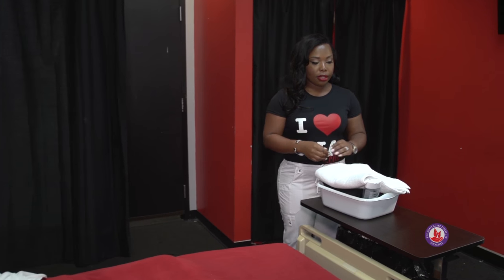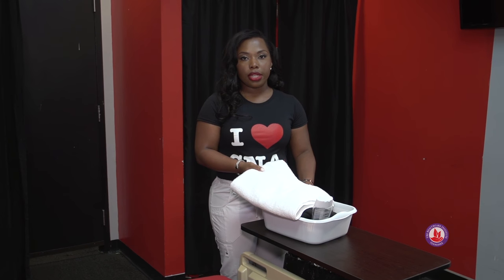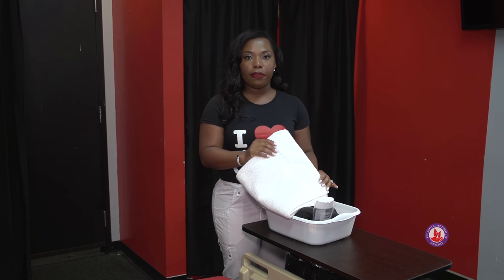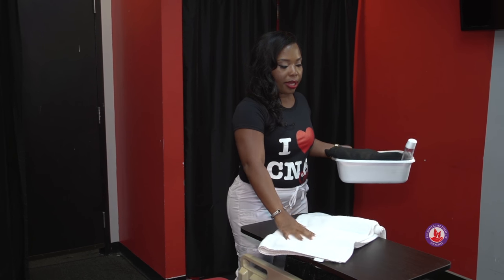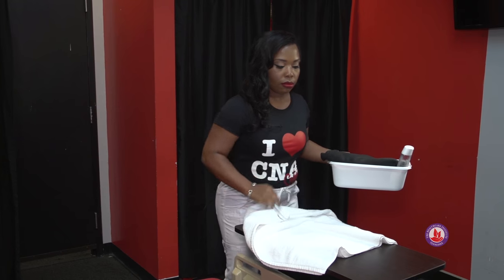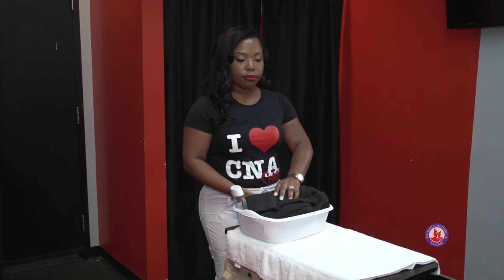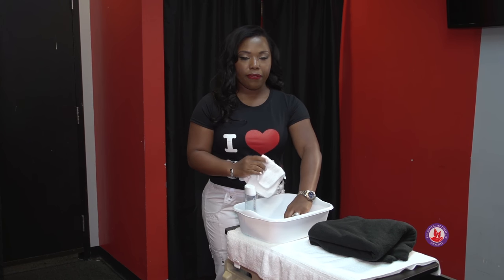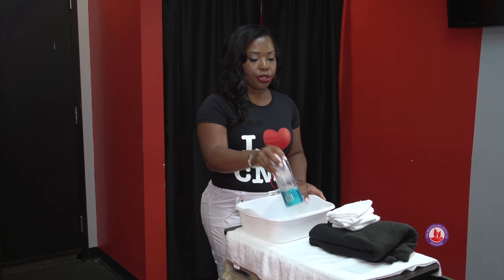Then we gather our supplies. Keep in mind when you gather your supplies, you don't want to touch your uniform. First thing we need is a towel for a barrier for our bedside table, so I'm going to place my barrier on the bedside table. You're also going to need a basin, your privacy blanket, three to four washcloths, as well as your soap.